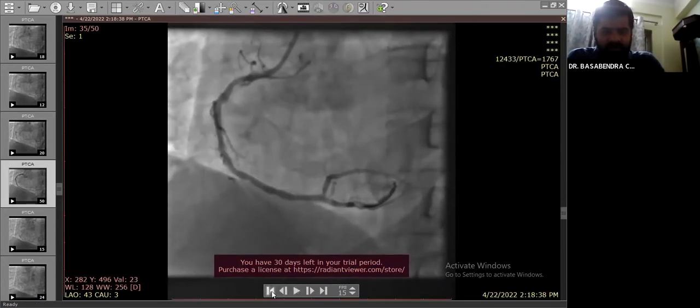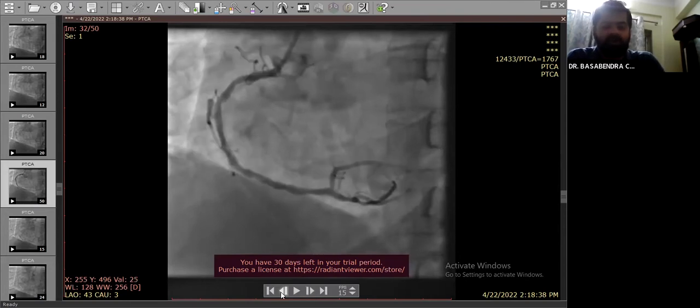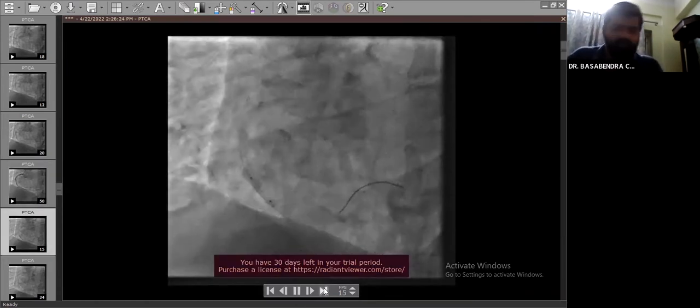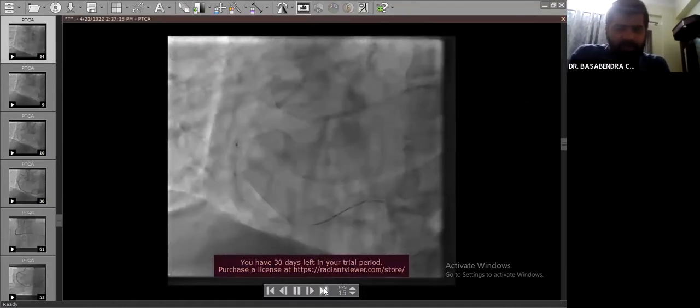After that, this was the picture, a significant improvement. Fair expansion at the distal part, the part which we were concerned about. We then decided to give a 2.75 NC balloon dilatation so that we could achieve fair stent expansion after stent delivery. So a 2.75 into 12 NC balloon was taken, and from the distal to the proximal part, the dilatation was done.